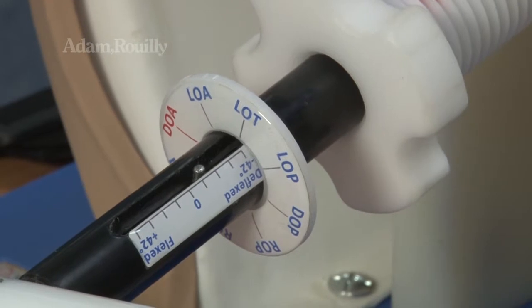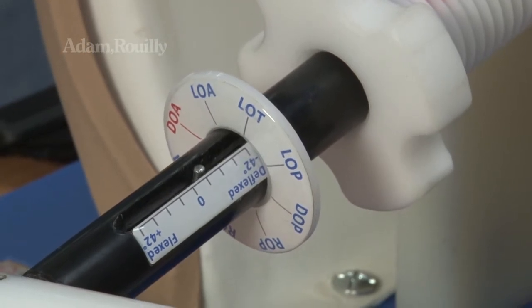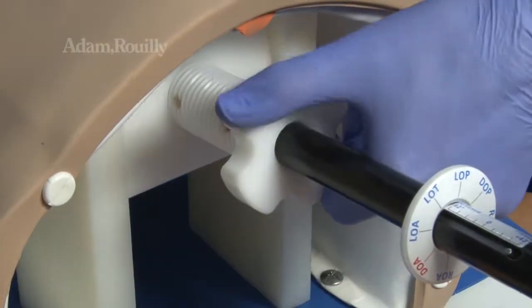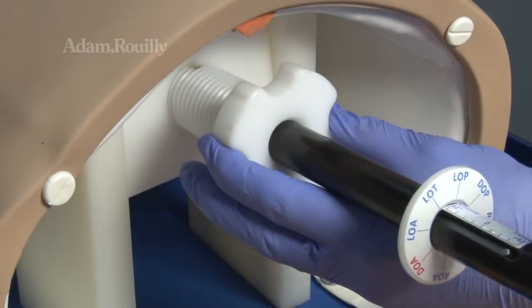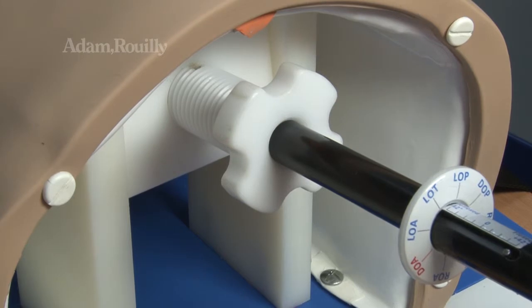Adjust fetal head flexion as shown on the flexion indicator. Impaction may now be increased by turning the difficulty adjuster clockwise from easy (green), to medium (yellow), or difficult (red).